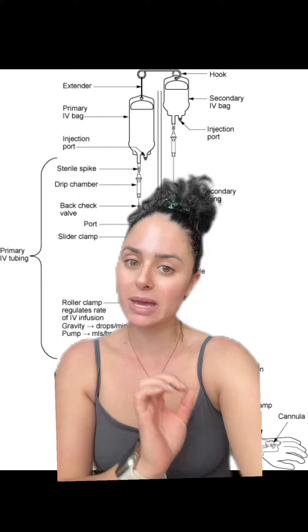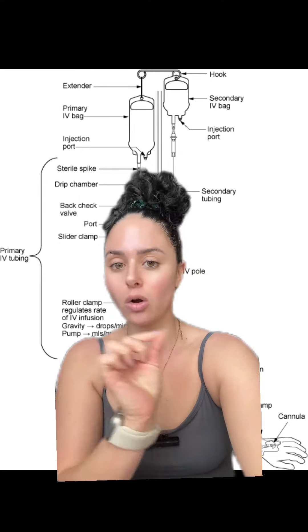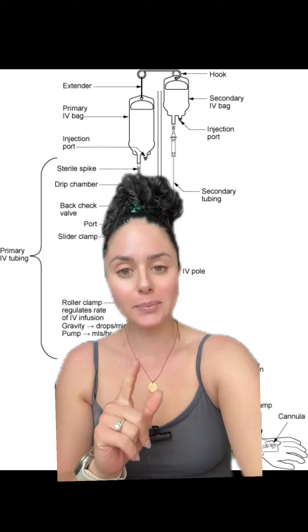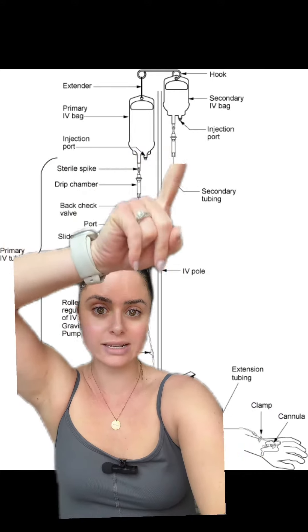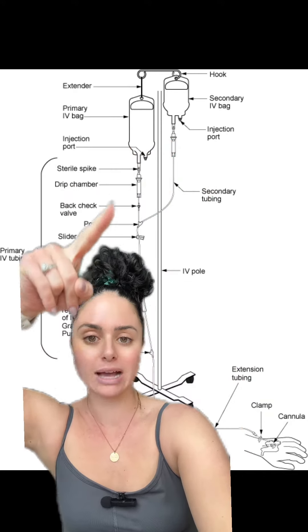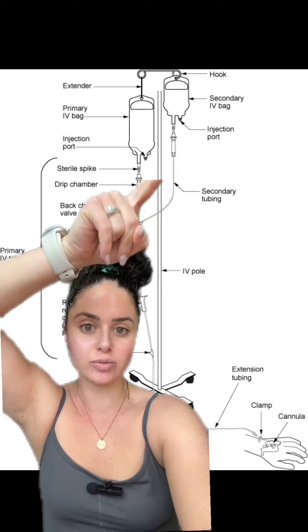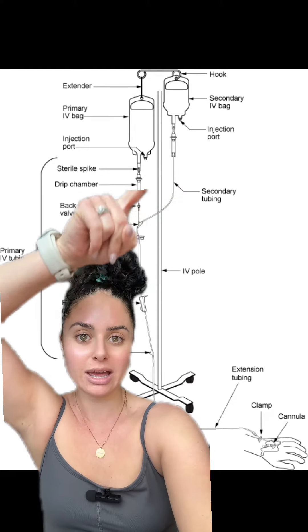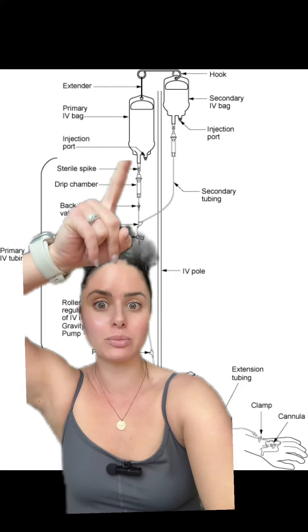Secondary infusions or IV piggybacks are smaller infusions that you're giving intermittently, like your antibiotics or electrolytes. To set up a secondary infusion, you need to hang your secondary bag higher than your primary bag. You can see how the secondary tubing is shorter and connects to your primary tubing, but the secondary bag hangs above the primary.